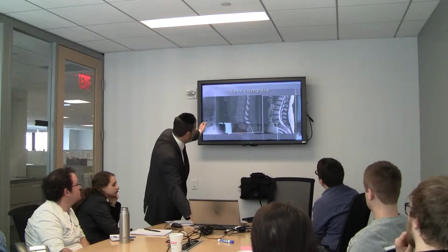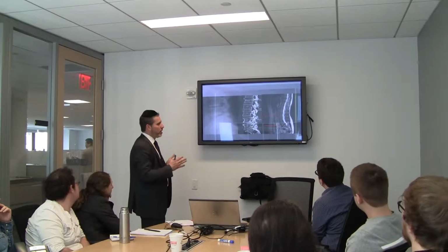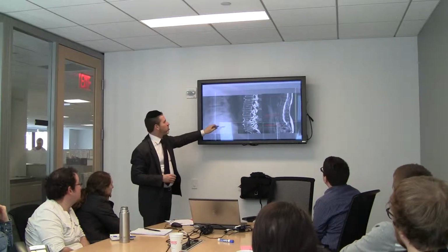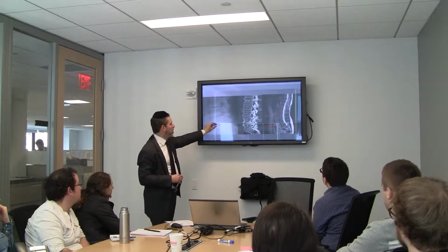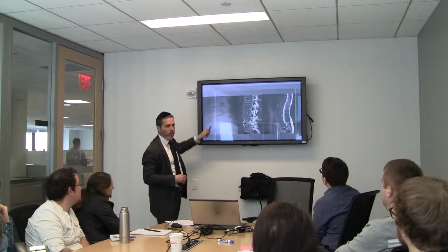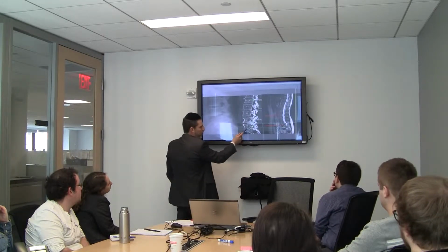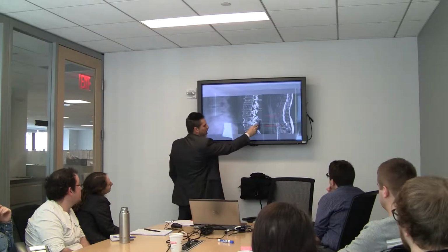Those are three essentially normal spines, and now we can compare what it looks like in some degree of abnormality. Here's an L5S1 degeneration, right? So the age of this spine is probably along the lines of 40 to 70. I would say maybe younger than 70 in the sense that these discs look pretty well preserved, so it looks like an isolated L5S1 degeneration. Take a look at this. CAT scan, degeneration, right? Collapsed disc, degenerated disc.